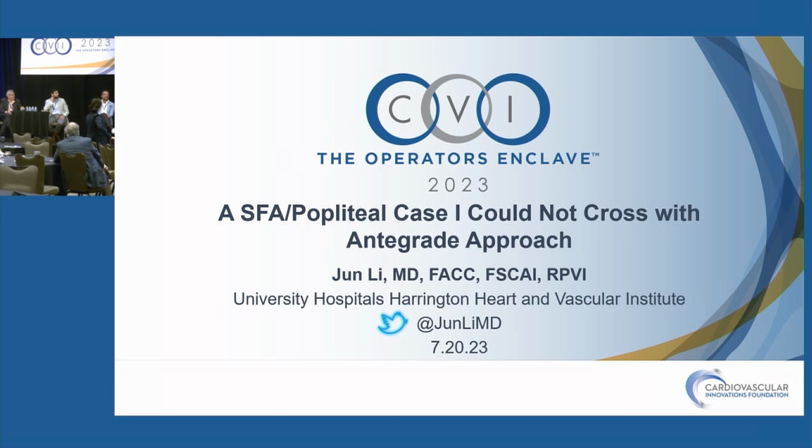In terms of diagnostic imaging, I just use it for access, not for diagnosis. So if femoral pulses are down, I'll use it. Otherwise, I'll use it to see if I can go antegrade versus if I would need to go cross-over. I never get CTA unless they have crazy surgeries that I don't have records on. I do a duplex on everybody. If I see the femoral is open but blunted waveforms, then I'll go radial and shoot from above. I don't use CTA much, but I do foot prep on everybody who has critical limb ischemia.